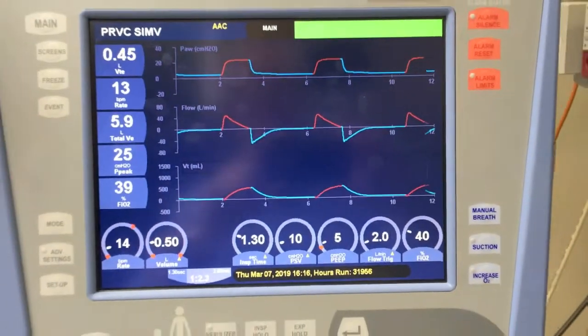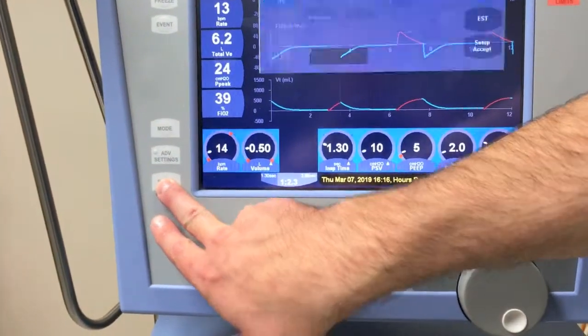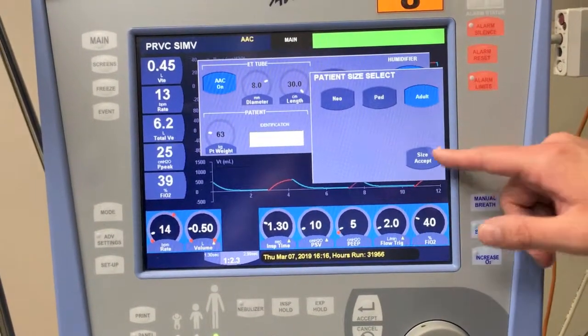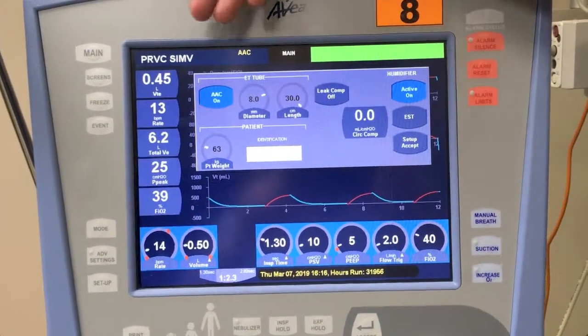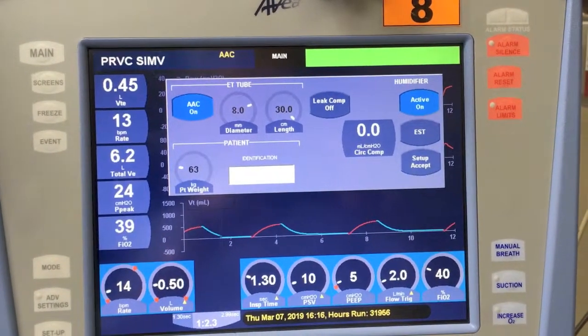Two things that are important for every nurse to do on their shift is to check the setup from the side here, to make sure we're set to adult as we don't have paediatrics or neonates, and to check that our leak compensation is off, which it should be for an endotracheal tube.